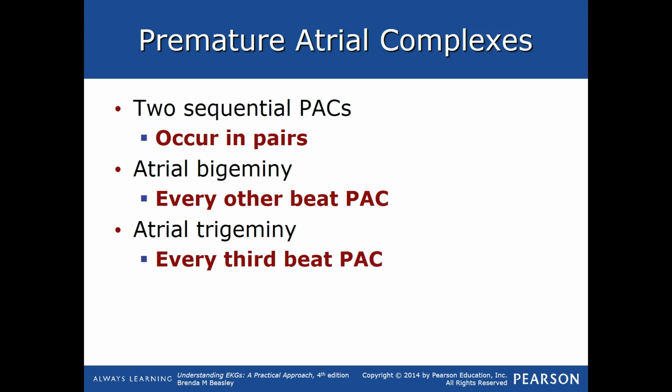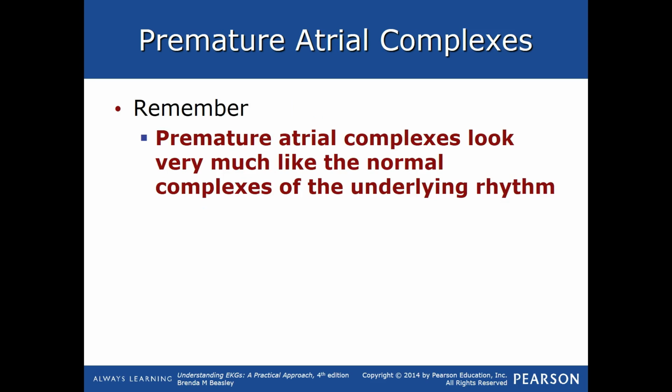Atrial bigeminy, so bigeminy meaning every other beat is a PAC. Atrial trigeminy, every third beat is a PAC. So trigeminy, bigeminy, that should make sense. Bi is paired, so every other; tri, every third.